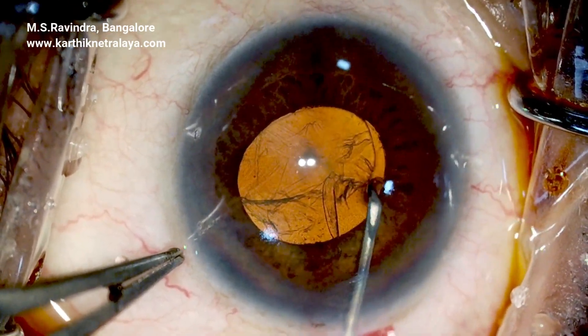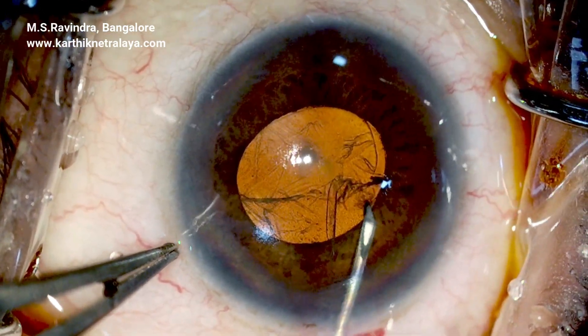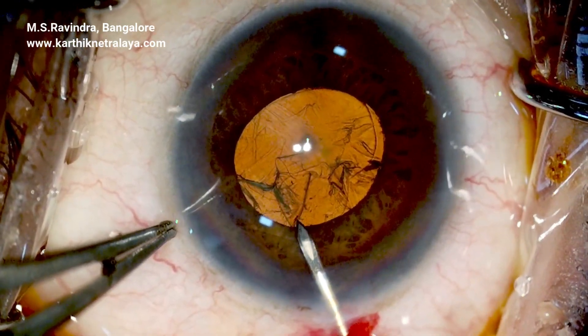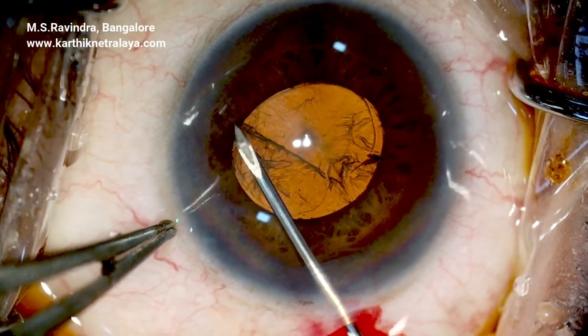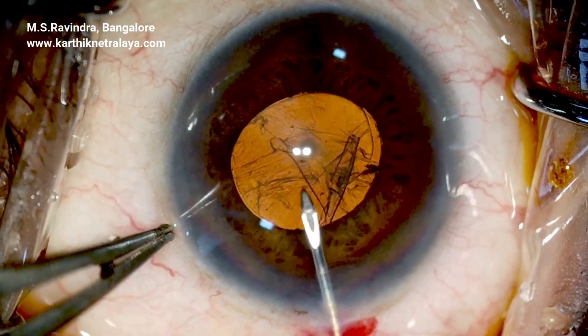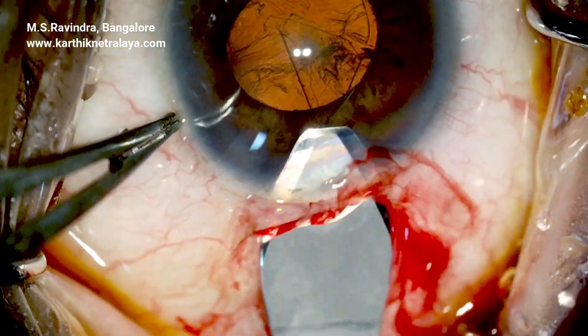A reverse rhexis is created at the place where the rhexis was started, by puncturing the intact anterior capsule a little away from the rhexis margin. That completes the reverse rhexis.